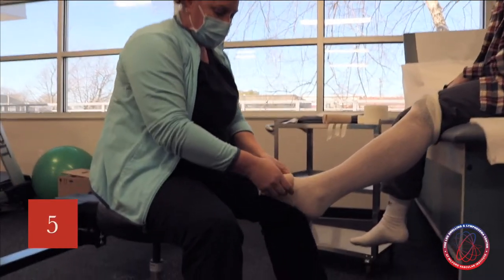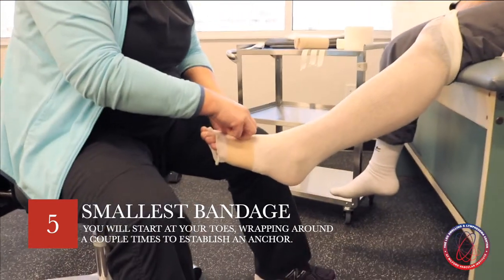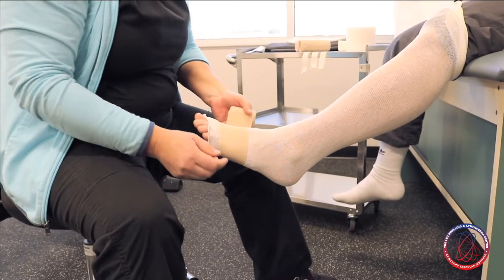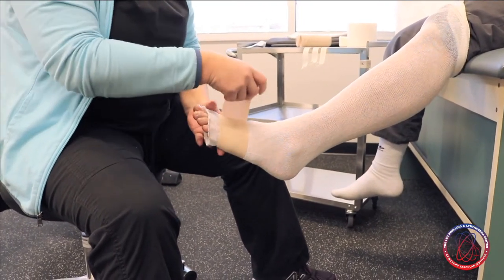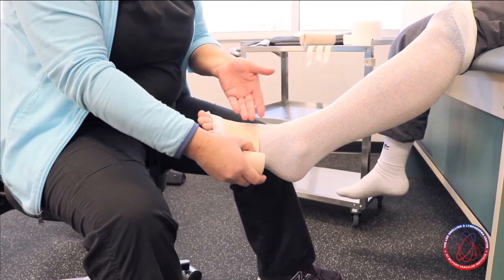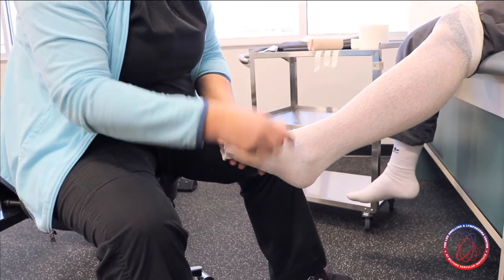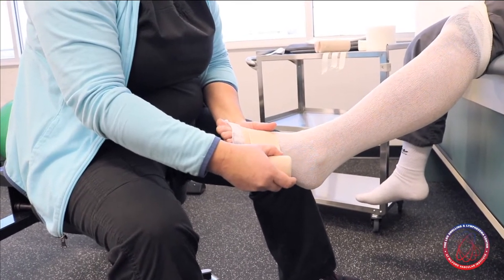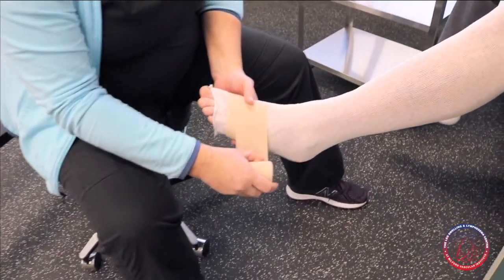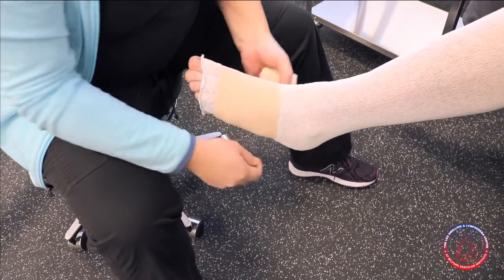Starting with the smallest one first, we're going to begin just at the base of the toes. We're going to wrap around the foot a couple of times to anchor the bandage. I'm not pulling too hard because this is going to overlap multiple times — I don't want to create too much pressure here. Once I've got my anchor in place and start working up the foot and leg, I'm going to pull just a little on the bandage to take the stretch out of it.